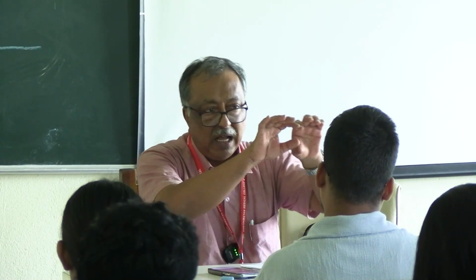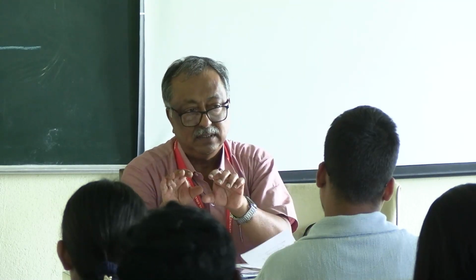One is the Bing test, another is the Gellé. The Gellé test was used when there was no acoustic reflex test or impedance audiometry. It is used for otosclerosis, the fixation of the ossicular chain, either the malleoincudal joint or the incudostapedial joint or the stapes footplate.